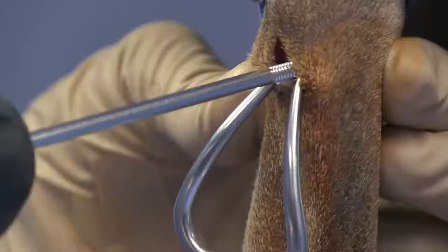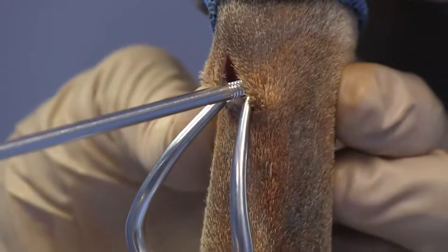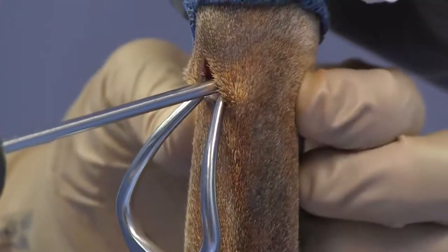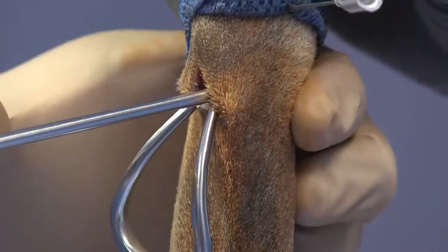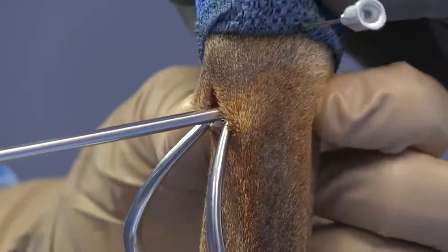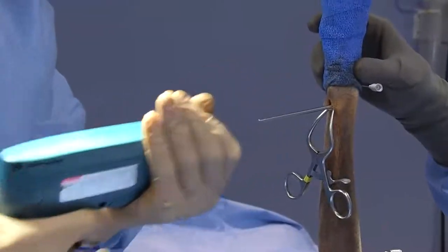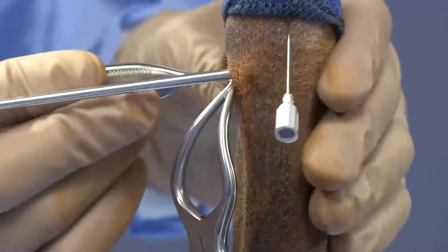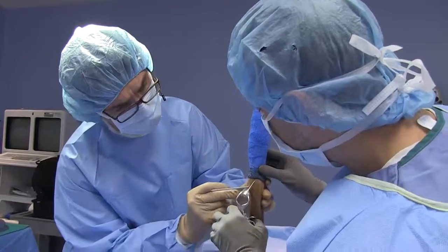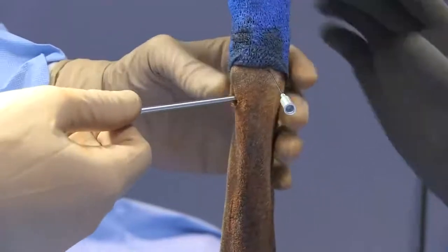I'm going to try to get my finger on the opposite side so I can feel when that pin starts to exit the opposite cortex, because I don't want too much sticking out into the soft tissues. I can actually palpate it right now, so we're going to go ahead and stop right there. We can go ahead and remove our Gelpis now — we've got our distal pin engaged.